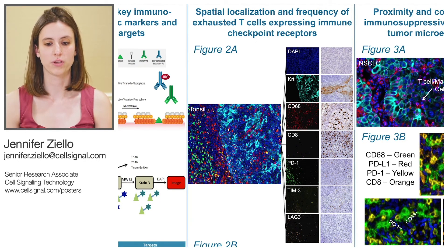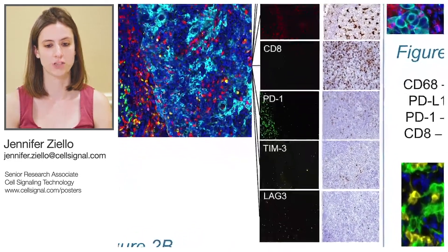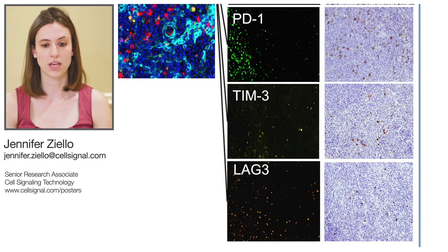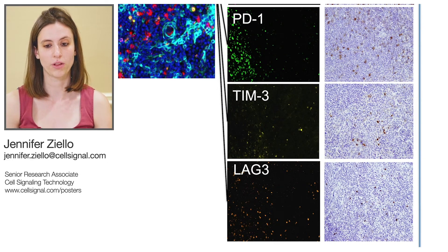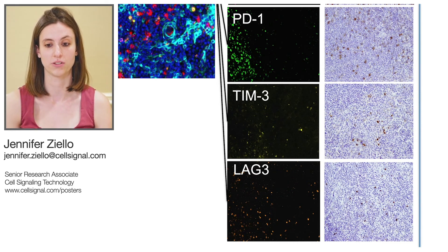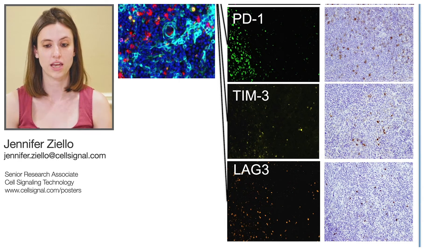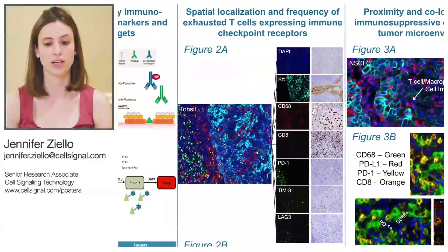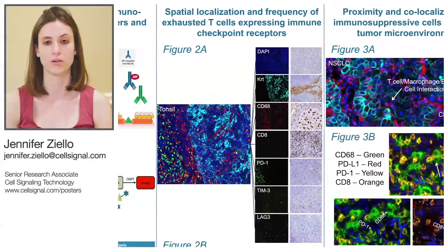When this panel was applied to a non-small cell lung carcinoma section, we can see quite a few CD-8 positive T-cells, as well as PD-1, TIM-3, and LAG-3 positive cells. When this image was analyzed quantitatively, we can see that while there are single and dual positive CD-8 positive T-cells present in this field, roughly 35% of the CD-8 positive cells in this image are positive for all three of the immune checkpoint receptors, indicating that there are quite a few exhausted T-cells in this tumor.